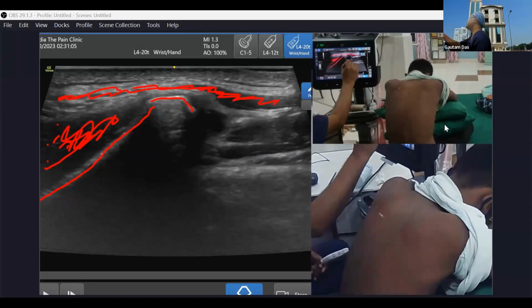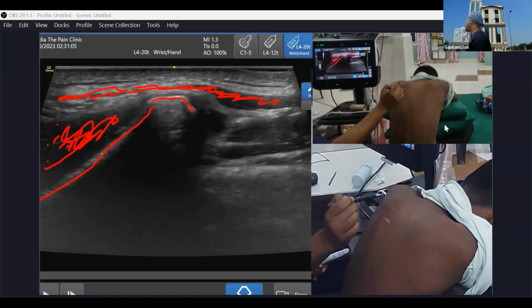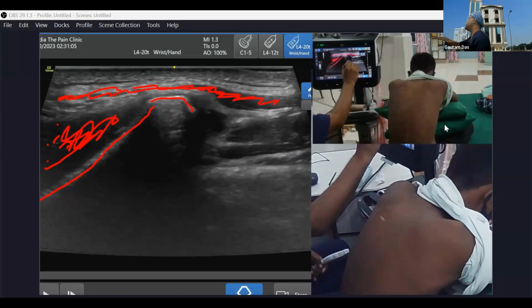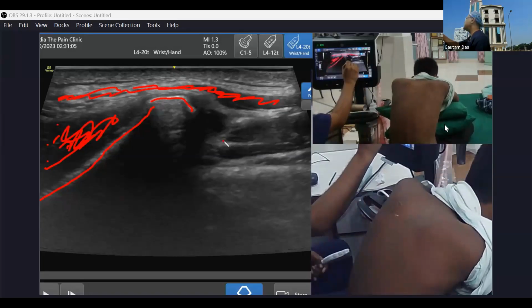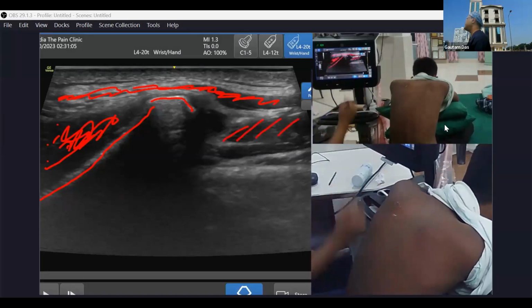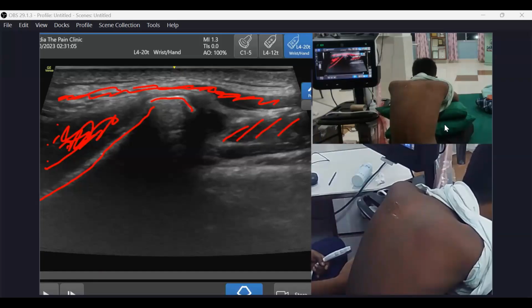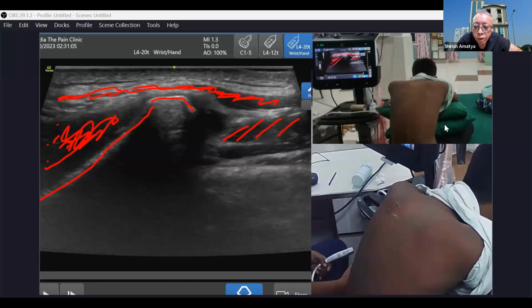And then I was above the spine of the scapula. So what will be the second layer muscle? Below the trapezius, above the spine of the scapula. Rhomboideus minor. Levator scapulae. At the level of the spine of the scapula it will be rhomboideus minor.